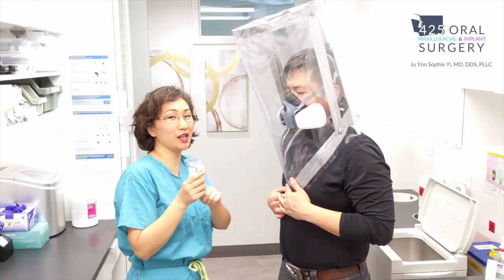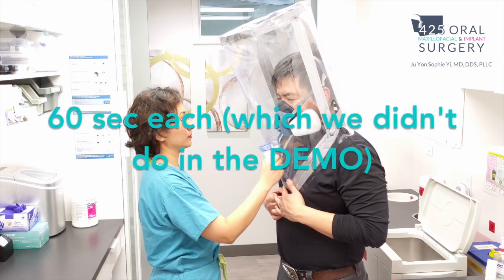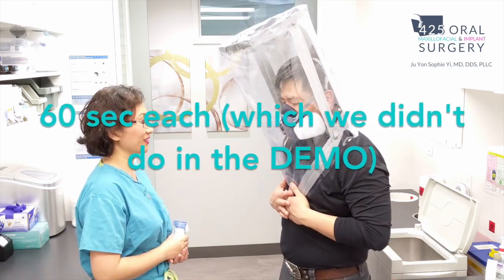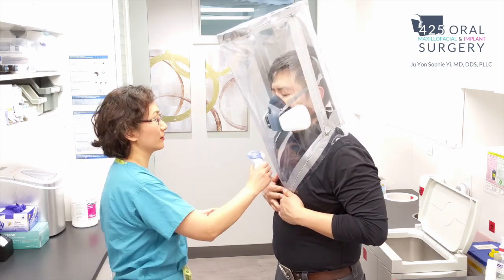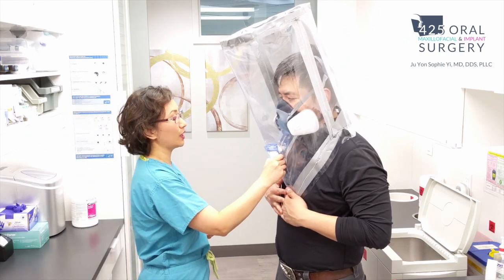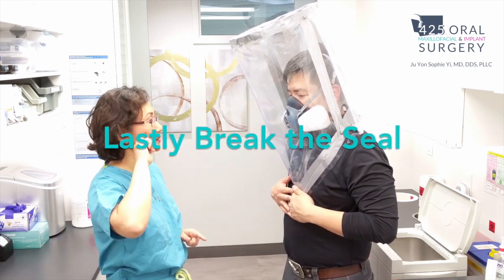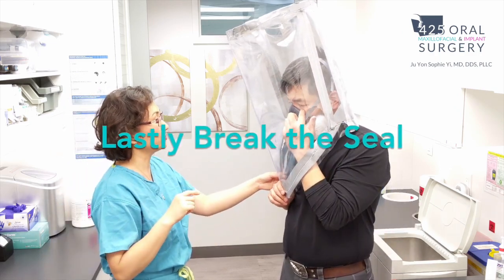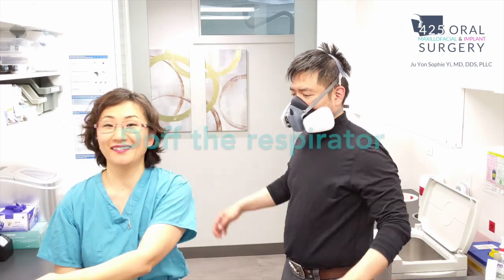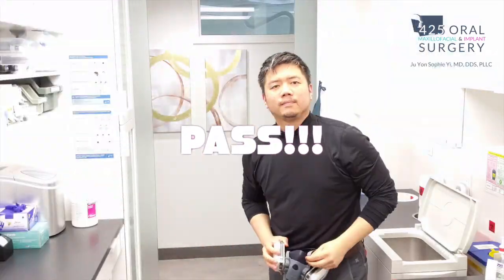Put the hood back on and spray the saccharine inside the hood again, and have them do various maneuvers that are on the fit test form. They're supposed to do 60 seconds of each maneuver, which we didn't do in this video. Lastly, have them break the seal before they take off their mask, and then they should be able to taste the saccharine. He passed.